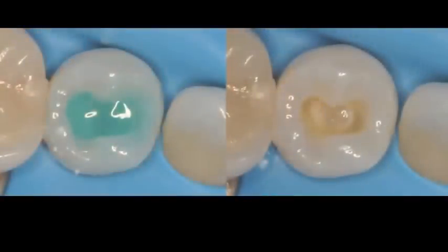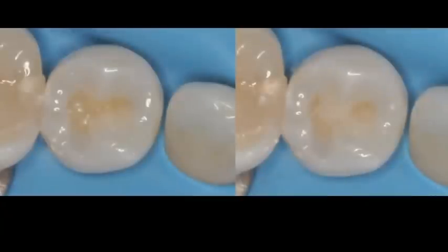So again, the preparation is very, very small, but fairly deep. It's deep, but not deep enough for me to have to consider anything special on the dentin. So I'm going to go ahead and acid etch. I'm going to do a total etch technique, rinse, leave the dentin moist, prime and bond, light cure the prime and bond, and then go about restoring. You can see that I've already placed my first layer of A4, my first horizontal layer.